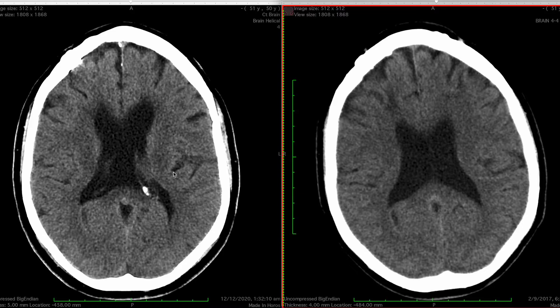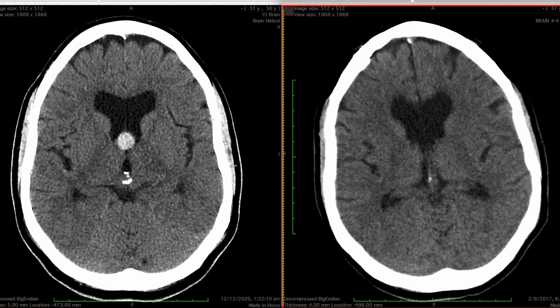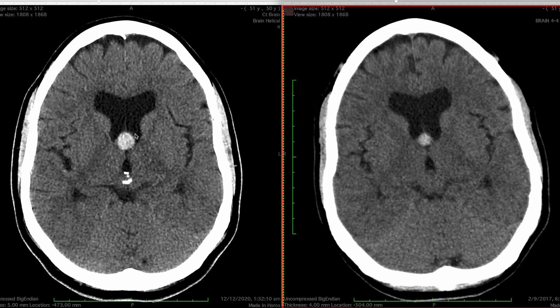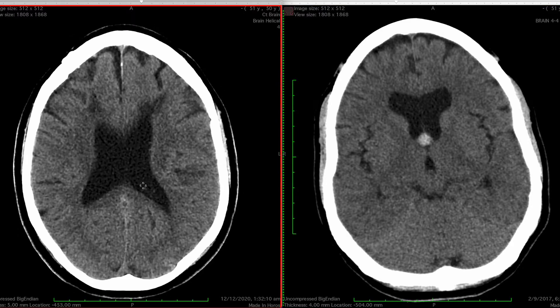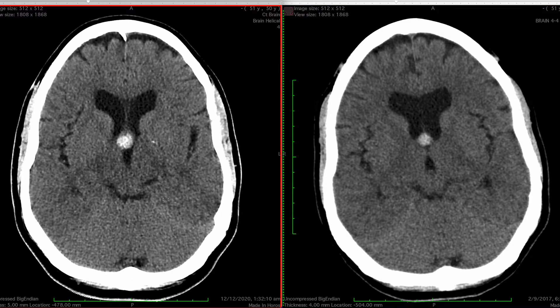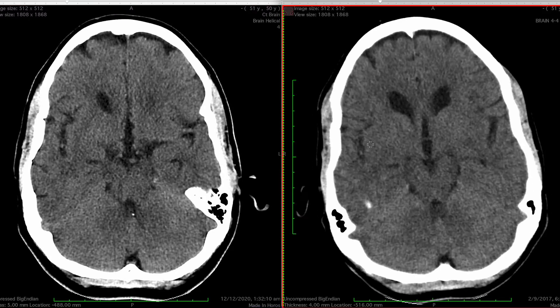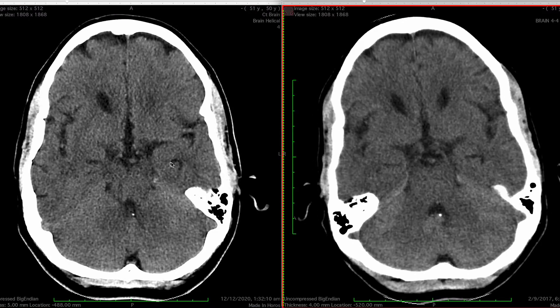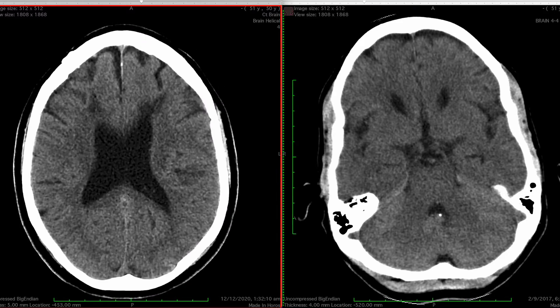Going to the more recent study, you can see that the colloid cyst is still there and has in fact grown a little since the previous scan. Again, we look for complications arising from this. Looking at the size of the lateral ventricles and going down to the temporal horns, we can see they are not dilated. So there is no evidence of acute obstructive hydrocephalus.